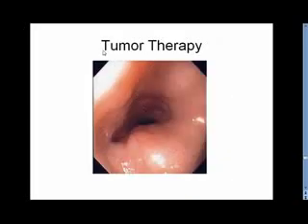Endoscopic ultrasound also holds great promise for tumor therapy, where we basically use our fine needle aspiration capability to direct therapeutic substances into tumors. Right now we're quite limited, and there are still studies going on with a number of different substances, but on a compassionate basis we have in our practice used alcohol in this patient or others where there was, for example, an extrinsic compression of the esophagus from a tumor metastasis.